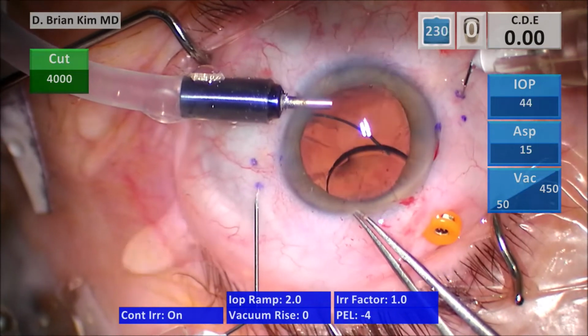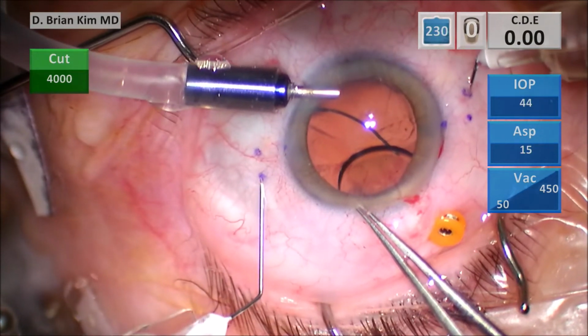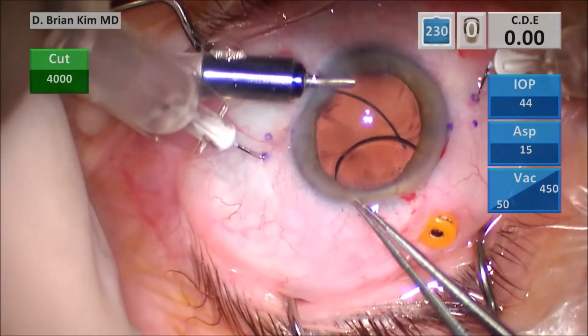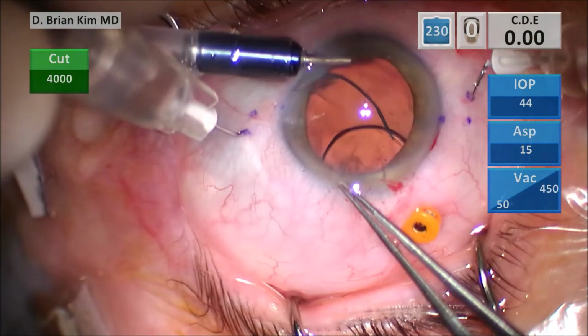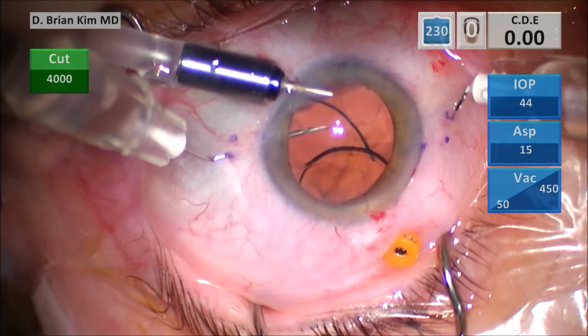You have to have infusion on with this maneuver. I have the needle, again, fairly flat to the sclera, puncturing at that first mark, tunneling fairly flat through the sclera, 2 millimeters, and then diving towards the nerve, and then rotating up.